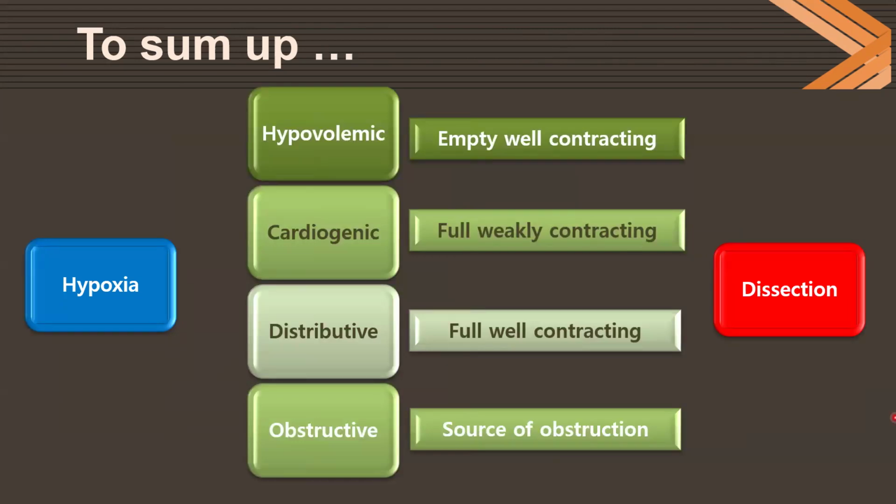The role of transthoracic echo in distinguishing different types of shock is very obvious.